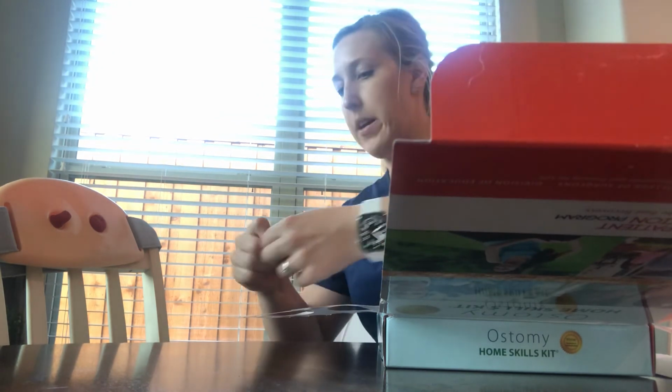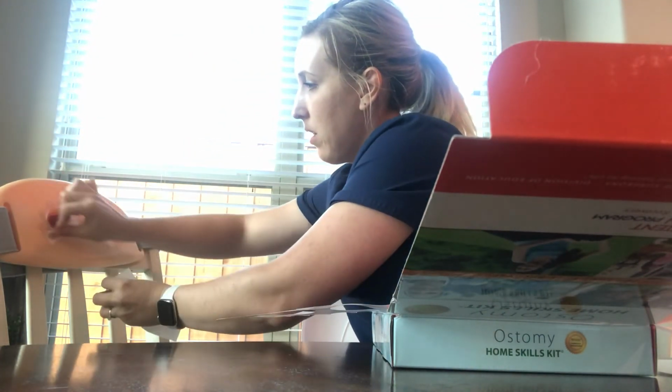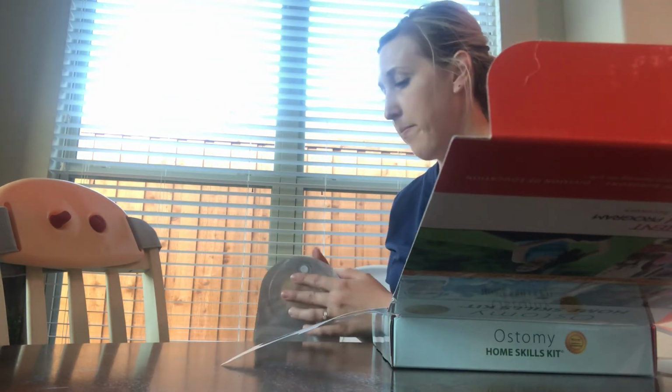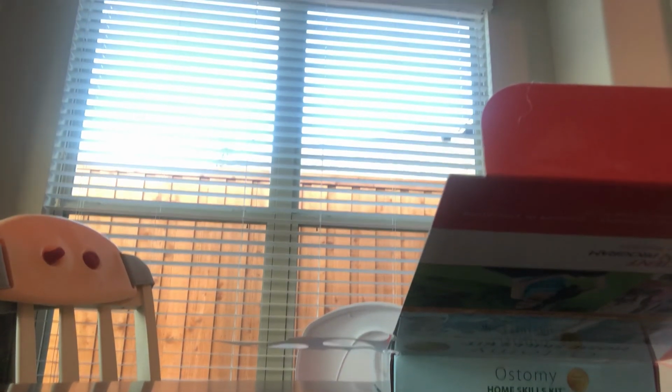Then you're going to use a no sting barrier film. And during this time, you will want to have something covering the stoma. You're going to run that over. You're going to let that dry. And then you will pull the backing off. You'll want to check first just to make sure that it fits over, which it does. Once the barrier is dry, you'll pull the backing off of this. You'll move your tissue and throw it away. And you'll want to slide this over, and you'll want to make sure that you smooth down all around.